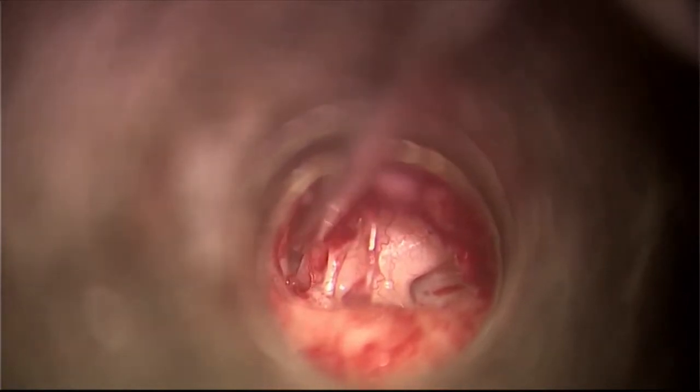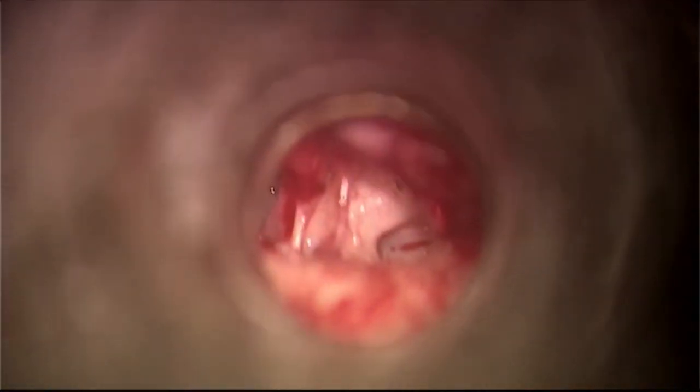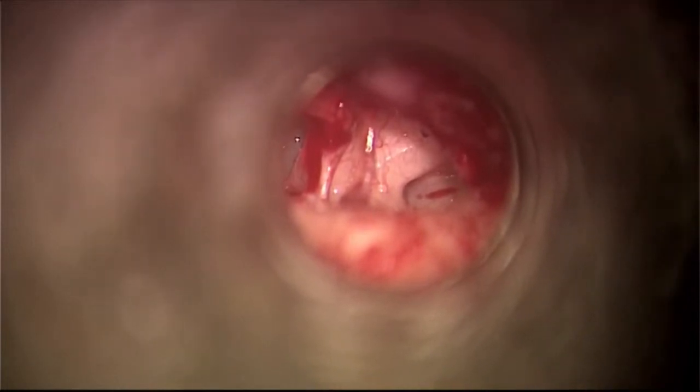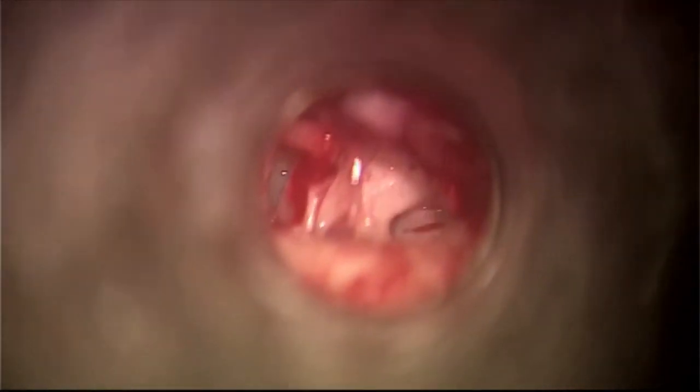See, with laser, what I am trying to say is the comfort level. First, I will do a rehearsal. Yes, that one shot is perfect. This laser cannot be attached to the endoscopic system. That needs certain things to be worked out. Next time we will do laser with the endoscope.